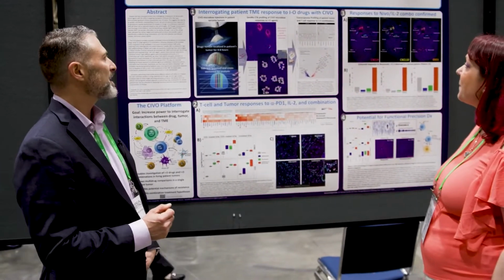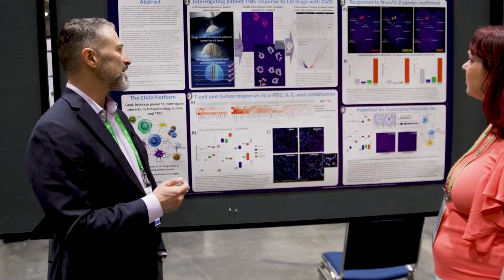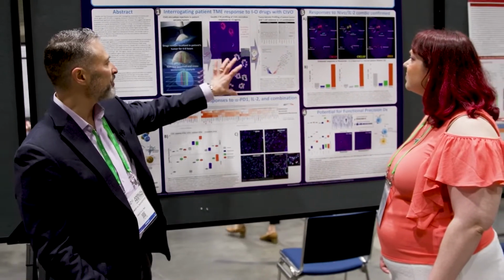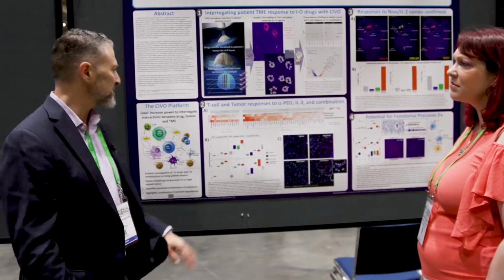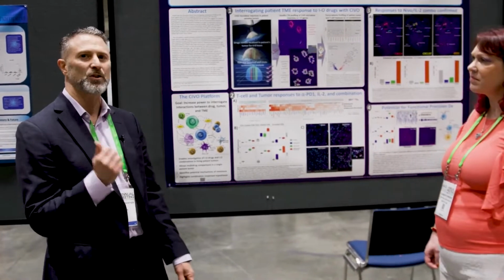We inserted a number of different agents, including the well-known checkpoint nivolumab, a classic version of a cytokine, IL-2, and combinations of those 2 drugs, and then profiled using digital spatial profiler to look at responses. One of the interesting things we did is to start getting into better understanding of the complex interactions between the tumor cells and various cells within the microenvironment.